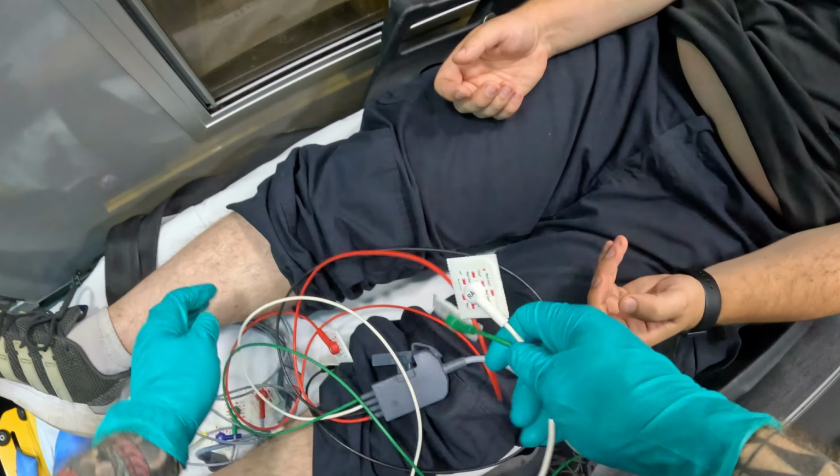So now I'm going to show you the controls on the LifePak 15. What you're going to do is turn on the monitor. I usually place it at the foot side of the patient, right by their feet. And now you'll see his underlying rhythm. We call this the three lead, and here you're going to see the heart rate once it catches up. I will give it a few seconds so that you see a good clear tracing.